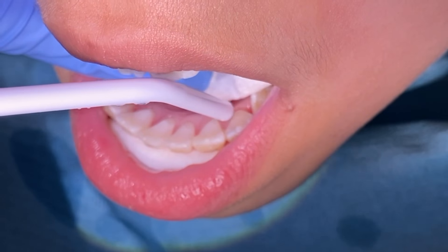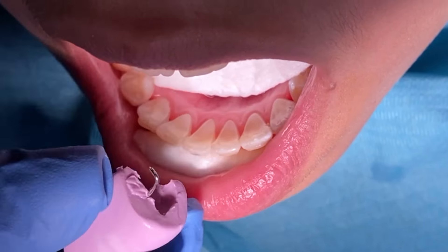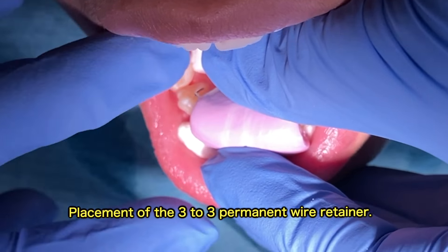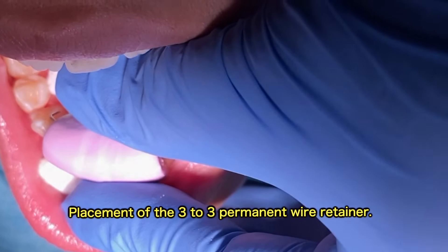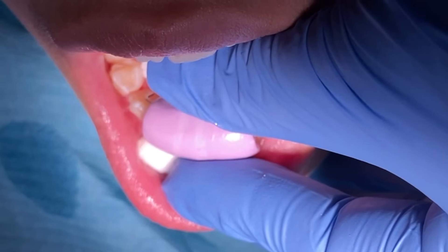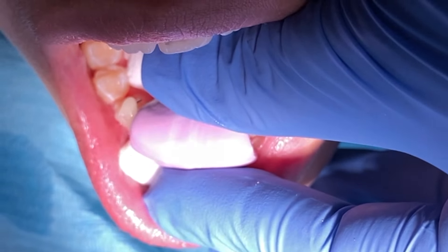Then you will blow some air, place the three-to-three wire retainer, and then you will apply the adhesive on there and then cure it with your light.